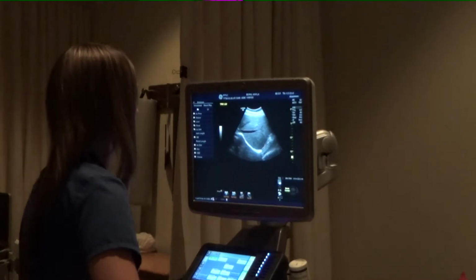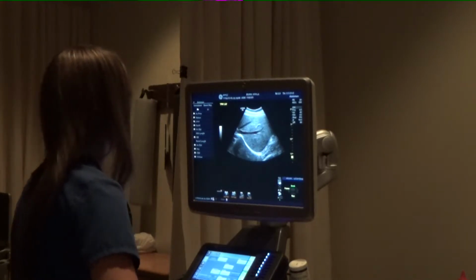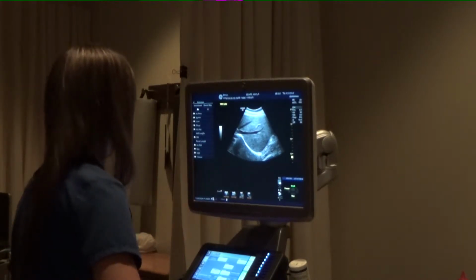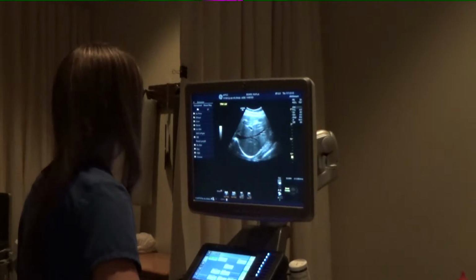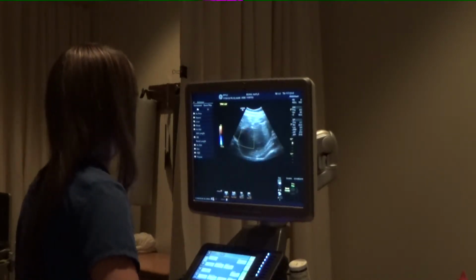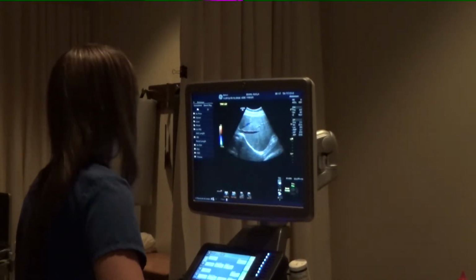And so what does that connect to, the hepatic vein? The IVC. Okay. And so what direction do you expect the flow to be in? It's going to be going away from the liver because it's draining the liver. So just show me that the direction is correct then. You're taking a breath in. There you go. It's good, so it's going away.